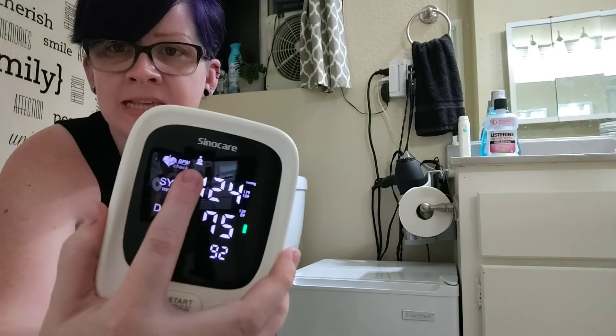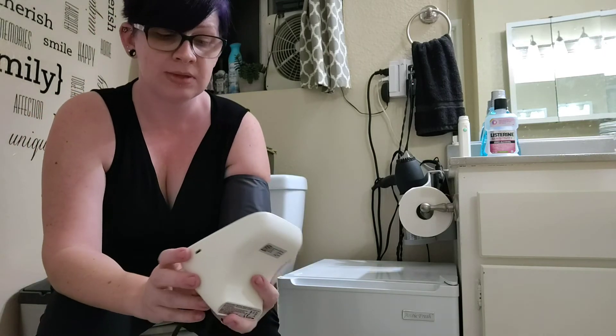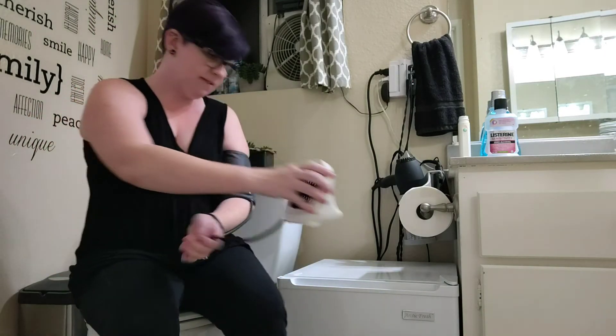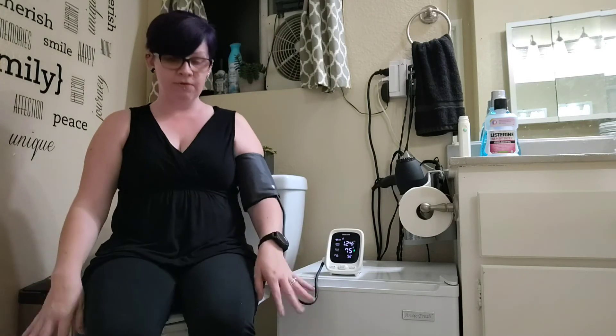I also have this set as user number one. You can set it to record numbers for two users, which is really great. My favorite part is that it tells you your readings out loud, reminds you to keep your cuff at heart level, keep your feet on the floor, and refrain from talking during the measurement.